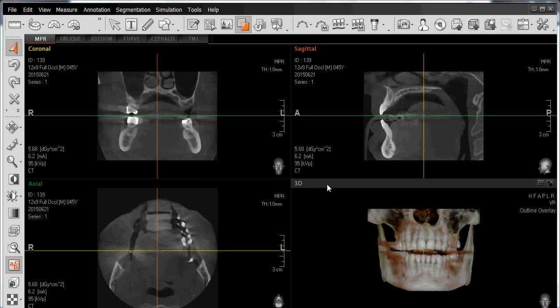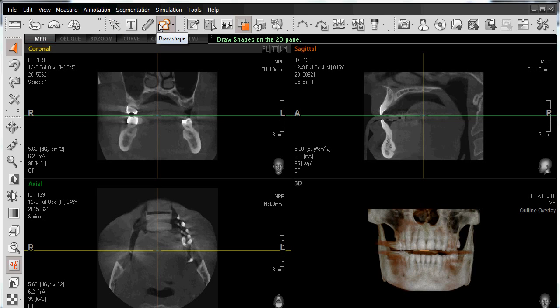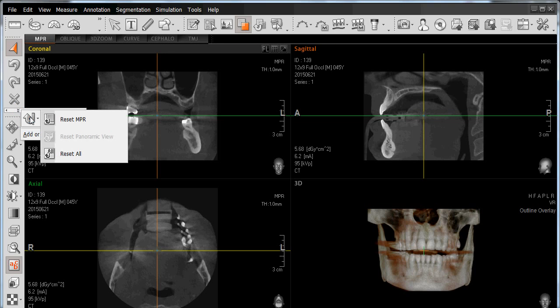It's also good to note that there are no tools, features, or functions within the software that will allow you to make any permanent changes to the original data itself. So regardless of what function I perform, if I decide I want to remove that function or I've gone in a direction with the treatment plan that isn't successful, I can always restore back to the very beginning by going to Reset and then left-clicking on Reset All.